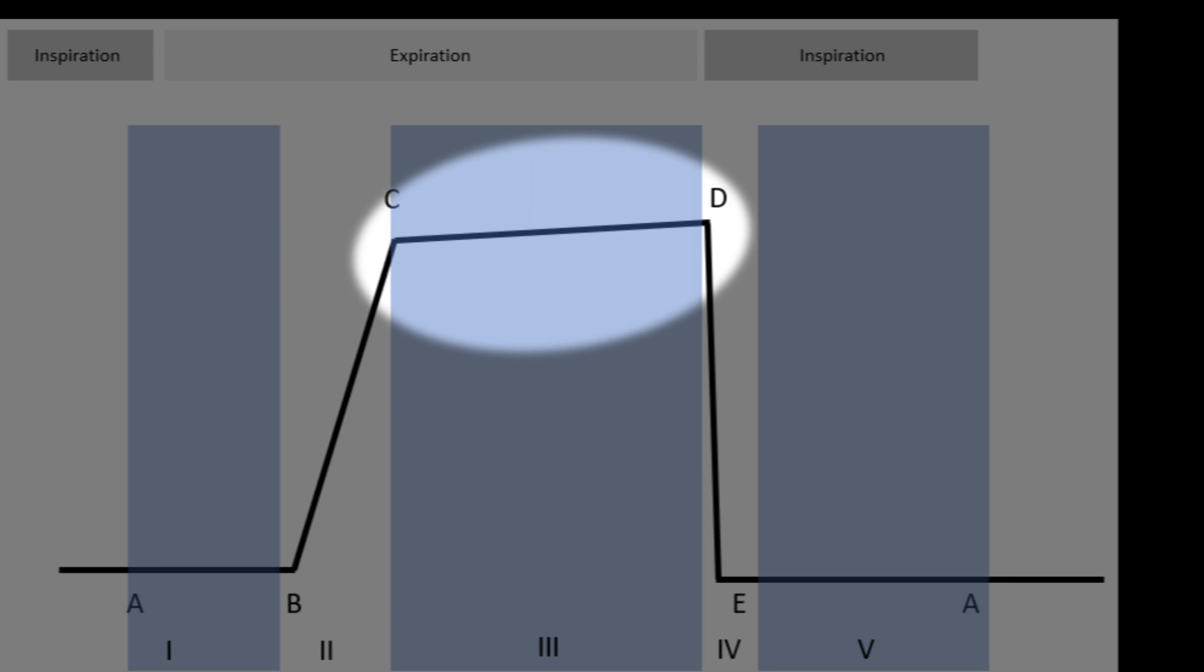Phase three, C to D. This is late expiration. All the gas that passes the sensor is alveolar gas, and this results in the alveolar plateau. This has a slight upward stroke, because not all alveoli have the same partial pressure of CO2. Those alveoli with the lower VQ ratio empty more slowly, contributing to the later part of phase three, which leads to the slight upward slope.